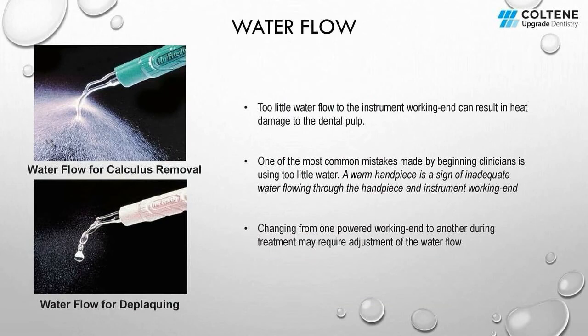In the previous slide, I mentioned that for calculus removal, a high frequency and high amplitude is required. So obviously, if a tip is working with such high power, the working end will also heat up sufficiently and the water flow has to correspond to it. The water flow for calculus removal is always going to be higher, as seen in the picture, than for deep plaque removal, where low frequency and low amplitude usually suffices in clinical cases.